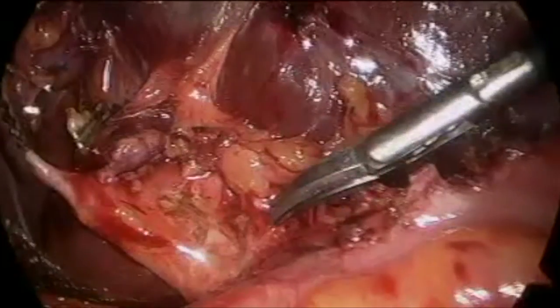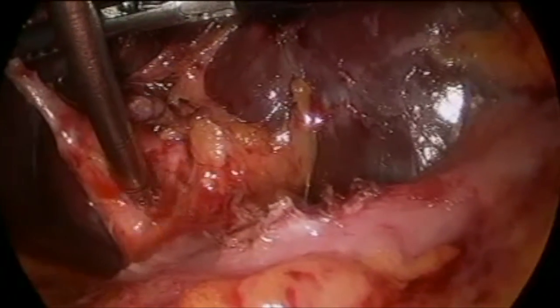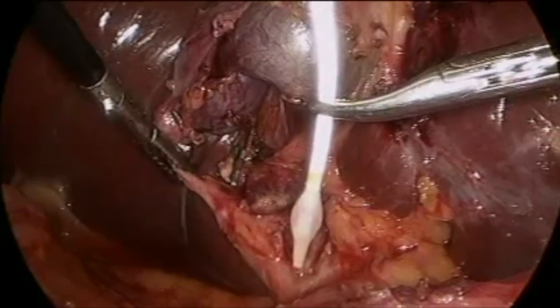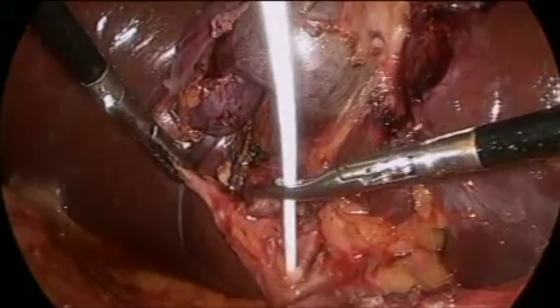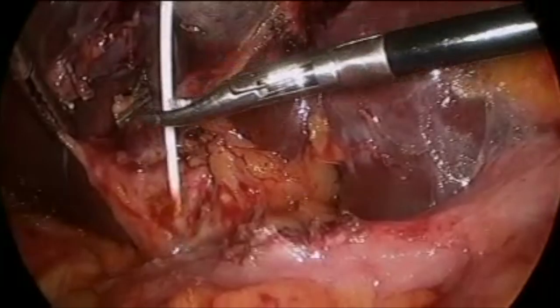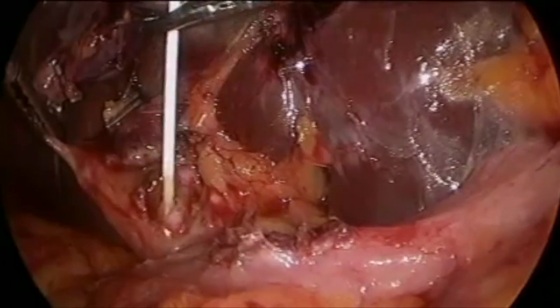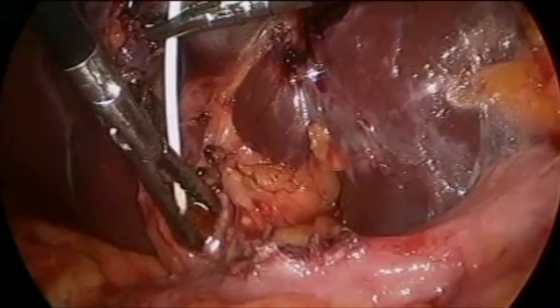A limited choledochotomy is performed and the duct is flushed copiously to see if the stone can be dislodged using this simple method, but this was unsuccessful. Therefore, a biliary Fogarty catheter was introduced into the distal bile duct. It is inflated and pulled back, and the stone emerges with the balloon and is removed using a grasper.